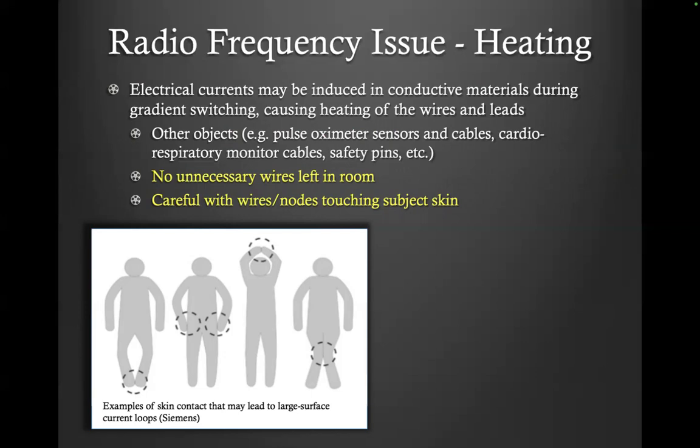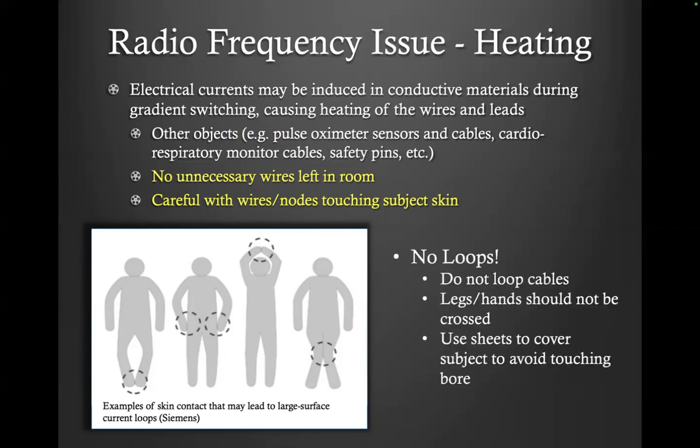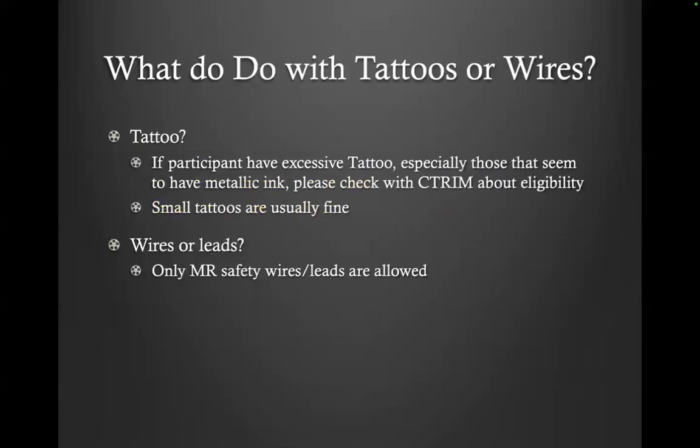We had an incident years ago where a patient had a heating burn because of sweat accumulated inside her thighs. So do not form any loops of cables. Legs and hands should not be crossed, and use sheets to cover the subject to avoid touching the bore. Just no looping, because loops are conductive loops, which is not good.